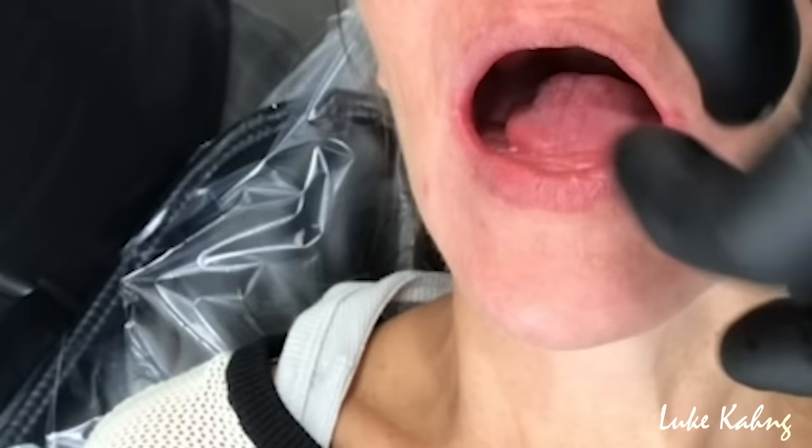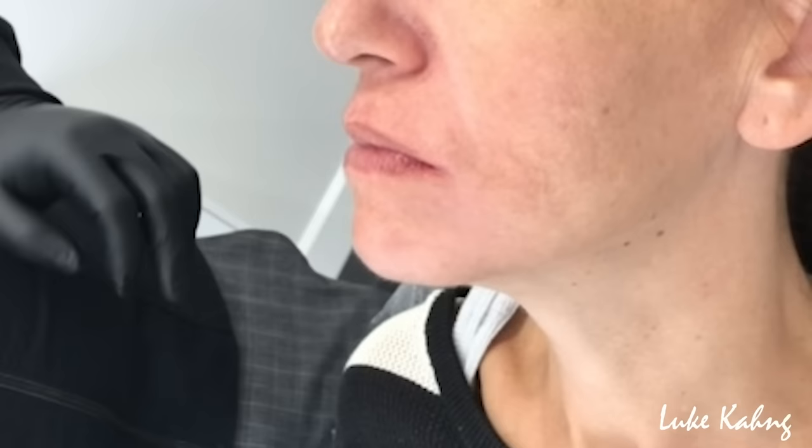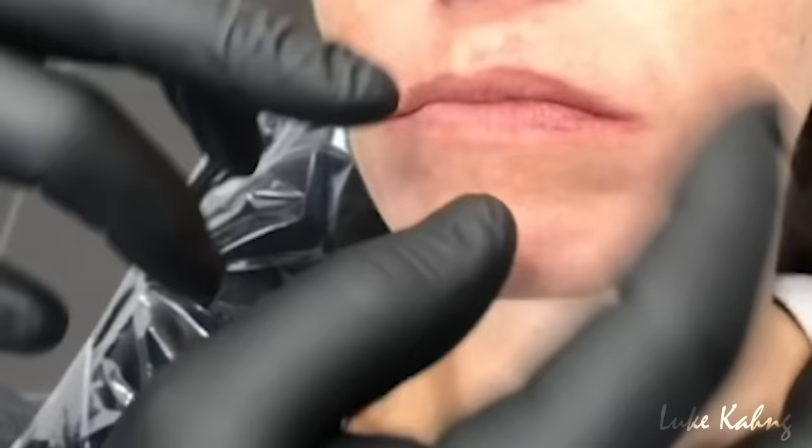When we go back to the trays that I sent, right down, you can close just fine, right? Just nice and comfortably, relaxed. Bring this back up here. Smile. See? Beautiful, nice teeth right there. And let your upper lip relax. Open. See? I see just the right amount.